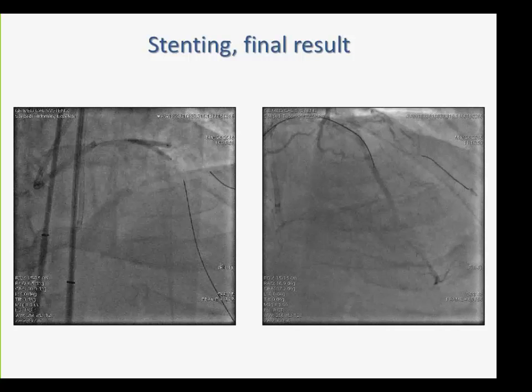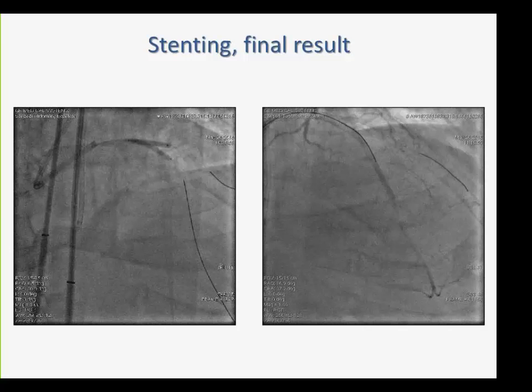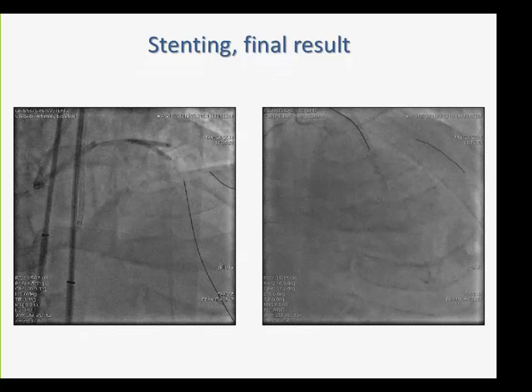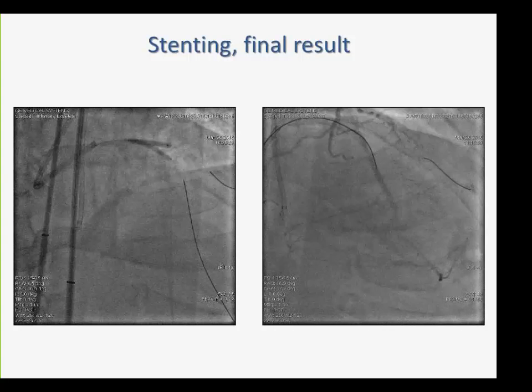And Imre, one quick question on this. Is the provisional approach working in cases like this where you have a side branch at the proximal cap? Do you find that provisional stenting works? Because some people have concerns that you have dissection in the branch and you might lose it if you do provisional. But it looks like in both cases so far, things worked out pretty well. What is your experience on that?